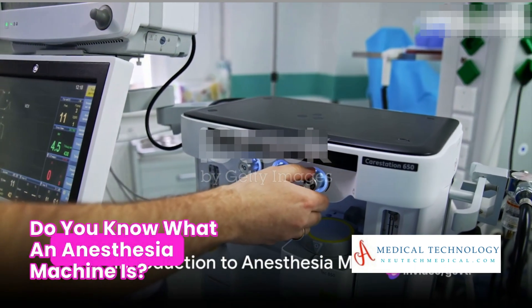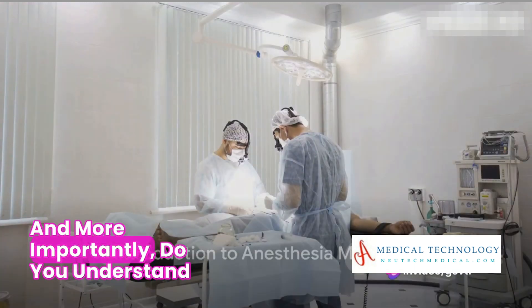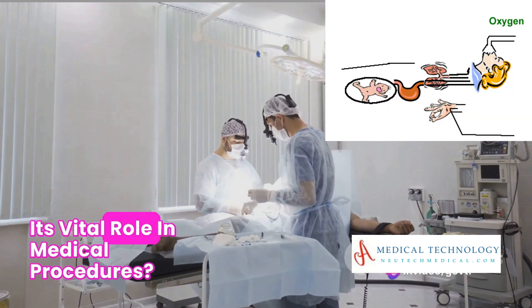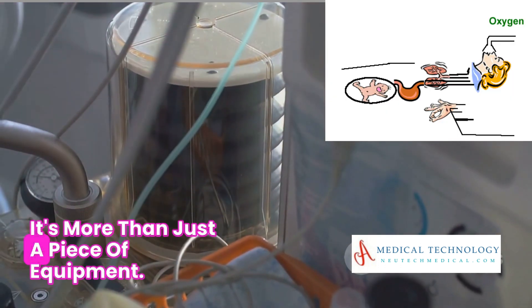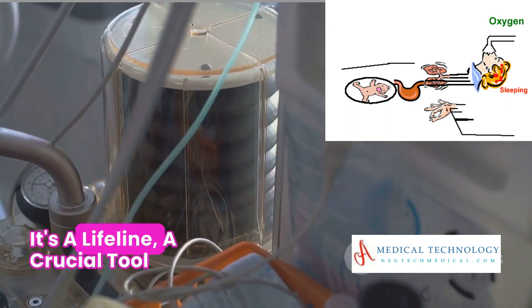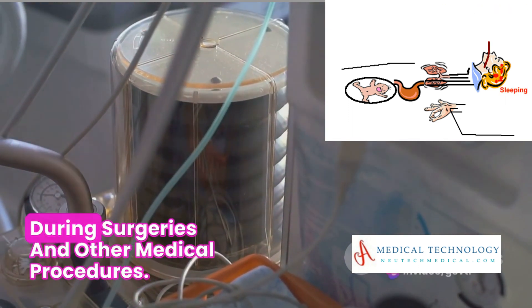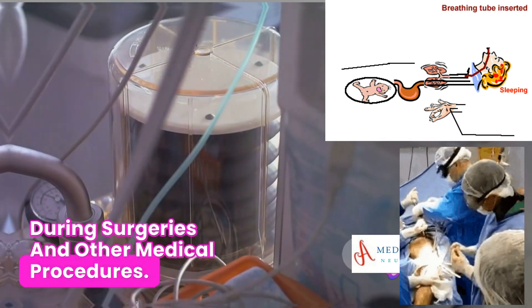Do you know what an anesthesia machine is? And more importantly, do you understand its vital role in medical procedures? It's more than just a piece of equipment. It's a lifeline, a crucial tool for ensuring patient comfort and safety during surgeries and other medical procedures.